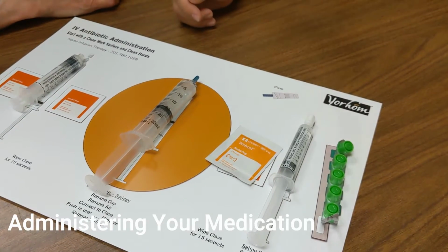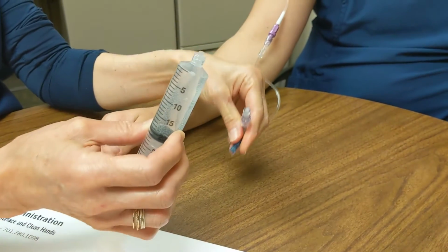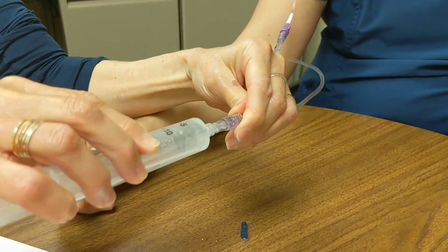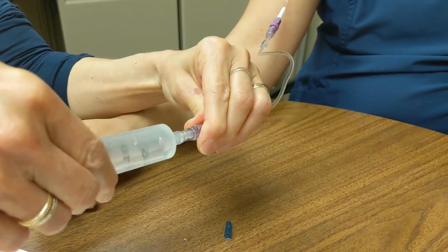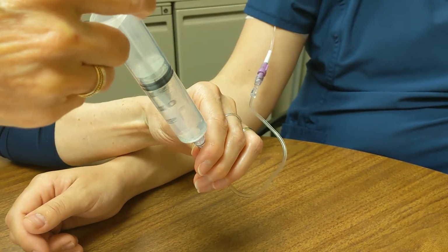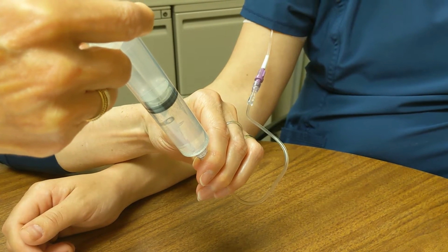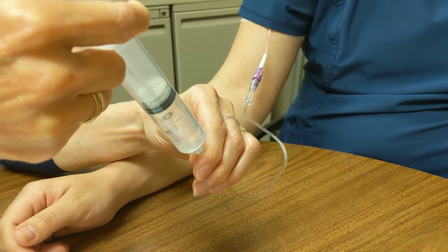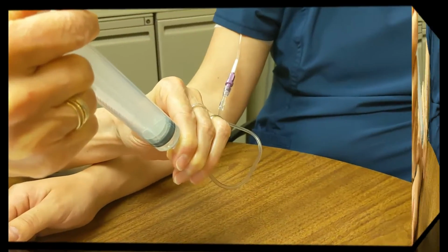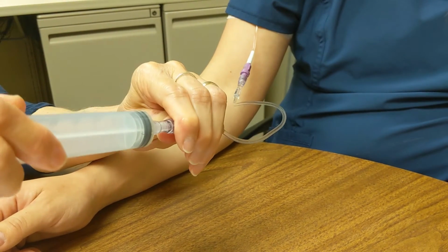Now you're ready to administer your medication. Remove the cap from the medication syringe tip. Push the syringe onto the clave connector using a push-twist motion, making sure it is secure. Then slowly push the plunger to administer the medication in the amount of time that you were instructed. We recommend using a watch or timer to properly administer your medication over the prescribed time. Once the medication is in, remove the syringe from the clave connector with a slight twisting motion.